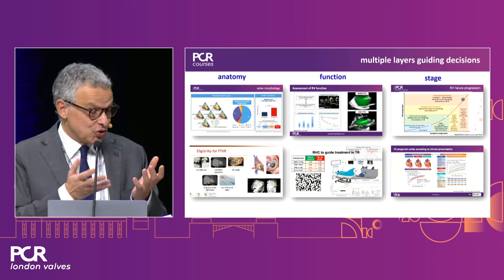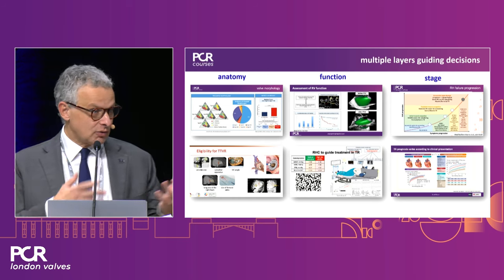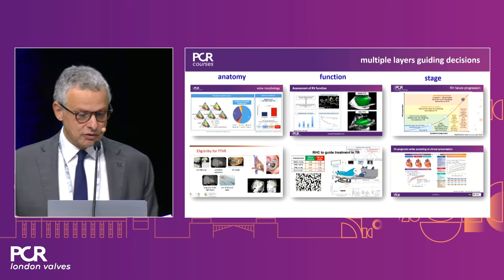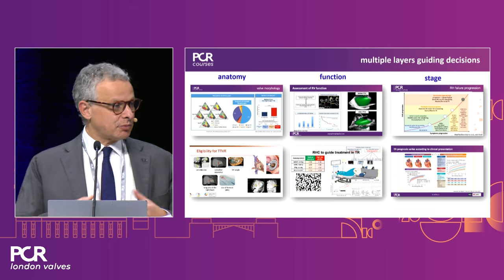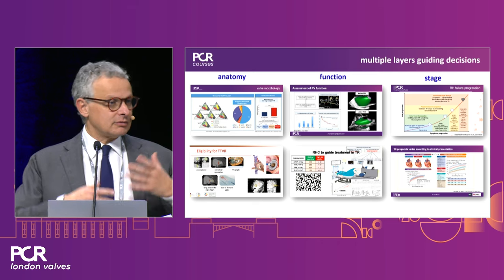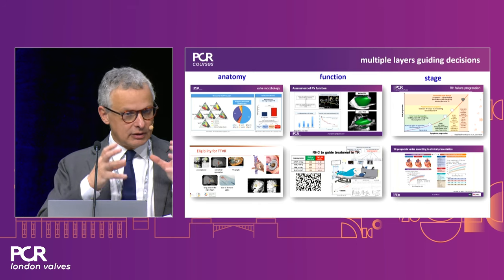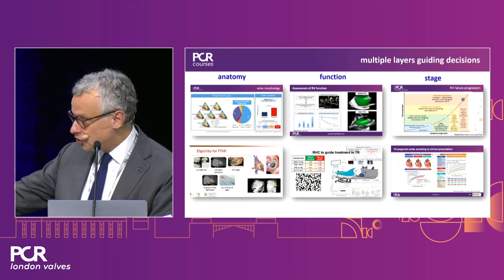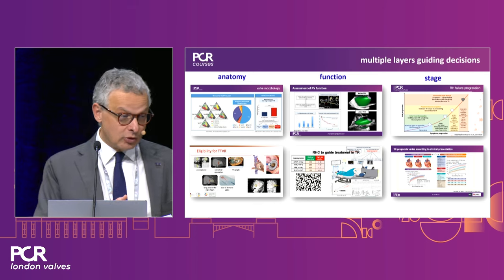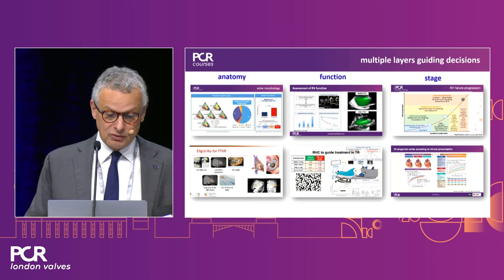But the anatomy is also a key factor for eligibility for TTVR in many patients because of what we have said: annular size and shape of the right ventricle, position of the papillary muscle, in some cases probably the location of the inferior vena cava and the angles, if you have early stage devices. So many anatomical constraints. Then there is the issue of RV function. We still don't know what the limit is. In the trials, we only accept patients with very good RV function. We don't accept patients with bad RV function.